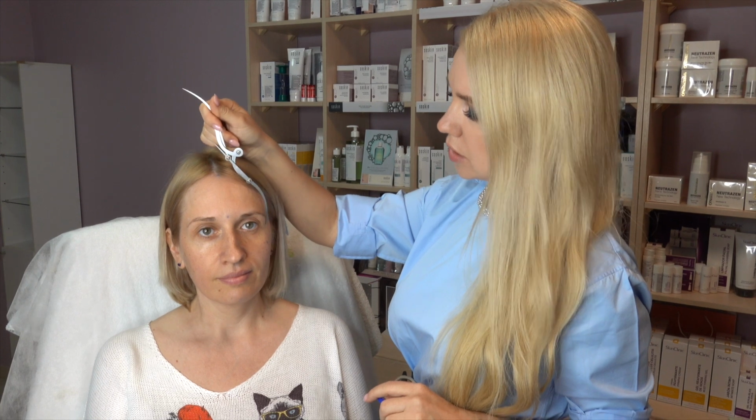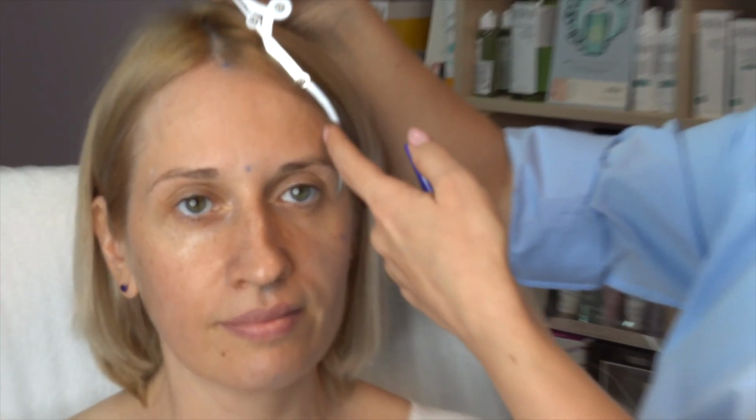I want to see the fullness of the temple area, and it's good. The position of the eyebrow is also good, and we already improved it with botulinum treatment. And let's summarize the plan.